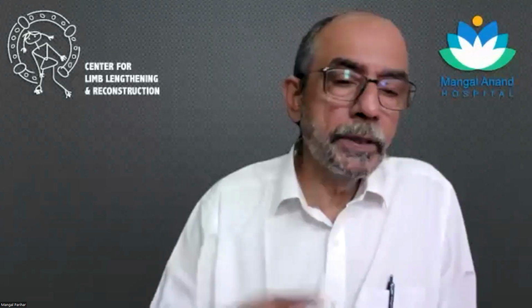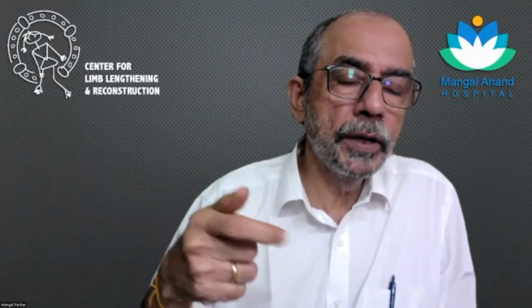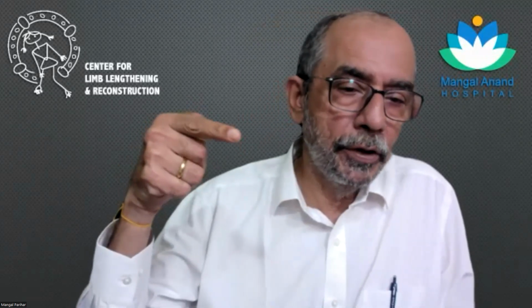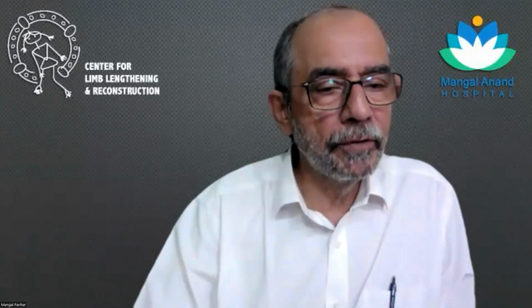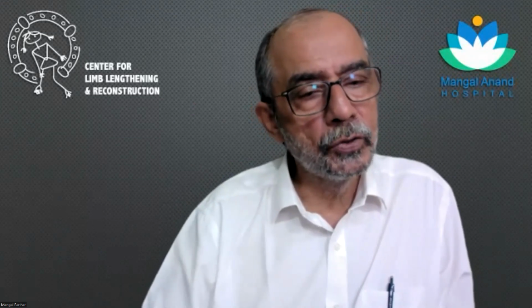I know, but what happens is when you are trying to get the longest possible monocortical screw, occasionally you go through the cortex. But if you keep track, you realize, okay, we've gone through the posterior cortex, and then you take a screw which is shorter.